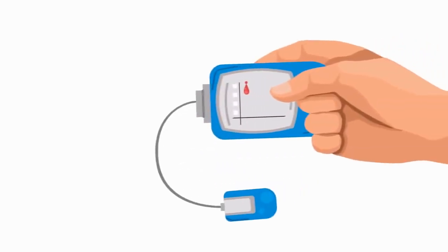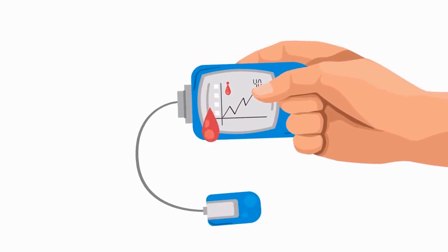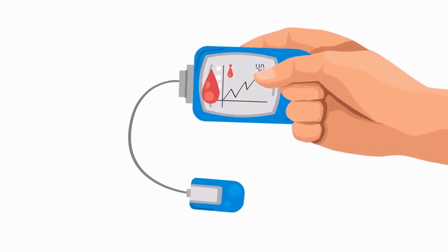It's important to note that while oximeters are valuable tools, they should not be used as standalone diagnostic devices. If you have concerns about your health or oxygen levels, it's essential to consult with a medical professional who can interpret the results and provide appropriate guidance.